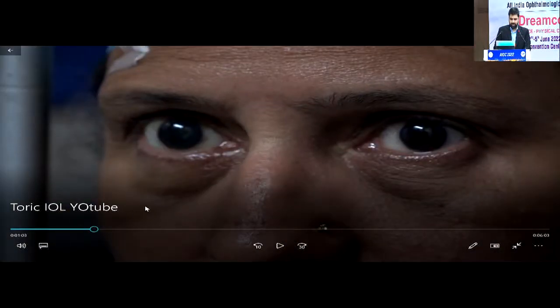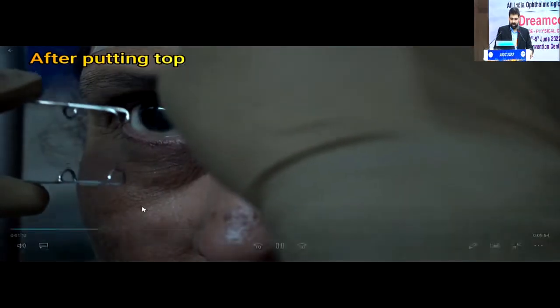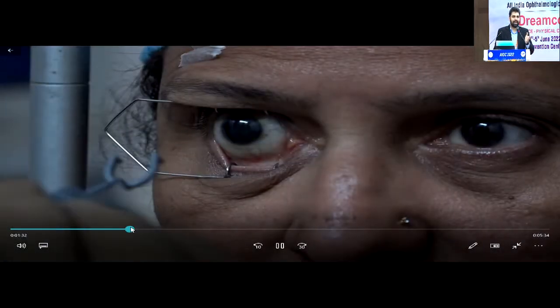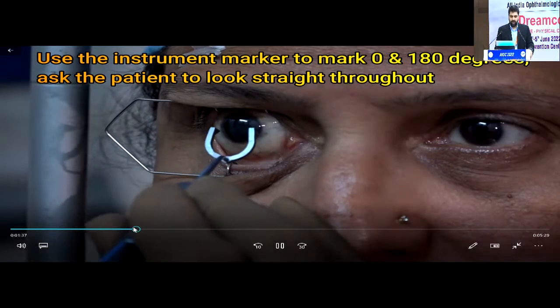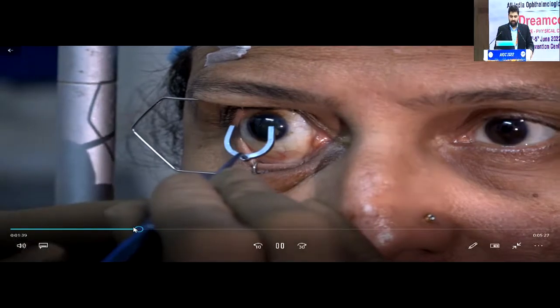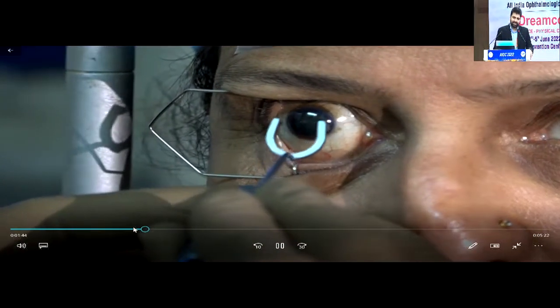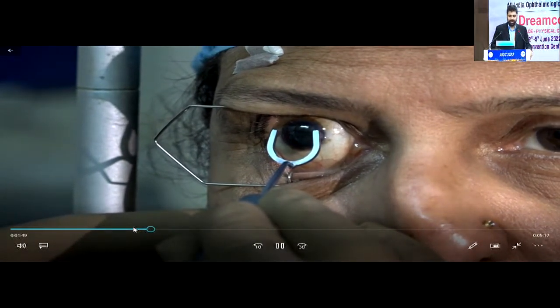Okay, this is just a video to show you how you should go about doing a marking. You should dry the area well after you've put your Paracaine eye drops, and putting a speculum at least in the beginning is really important. You put the speculum, you make the patient sit at the slit lamp so the chin is stable, and this is just showing you how you can use a simple gravity marker. And the inks are there. This is for 0, 180 degrees. Ask the patient to look straight. Probably you can put in a torch light and just mark it at 0, 180.